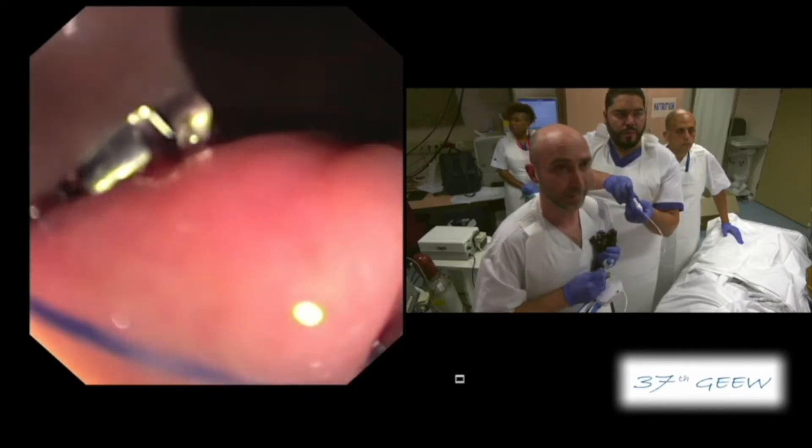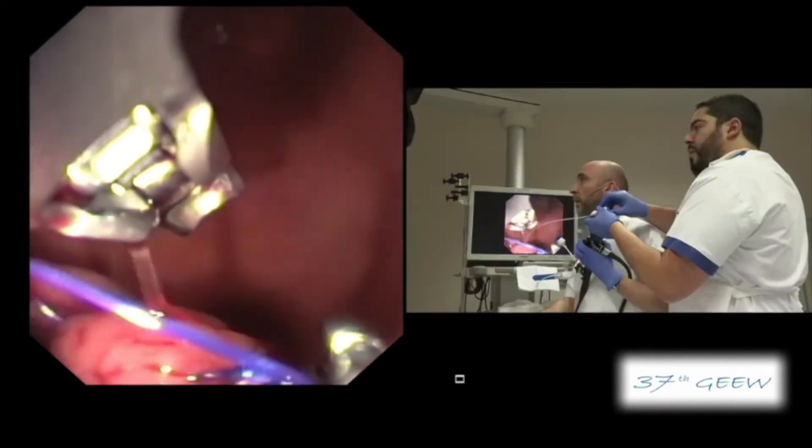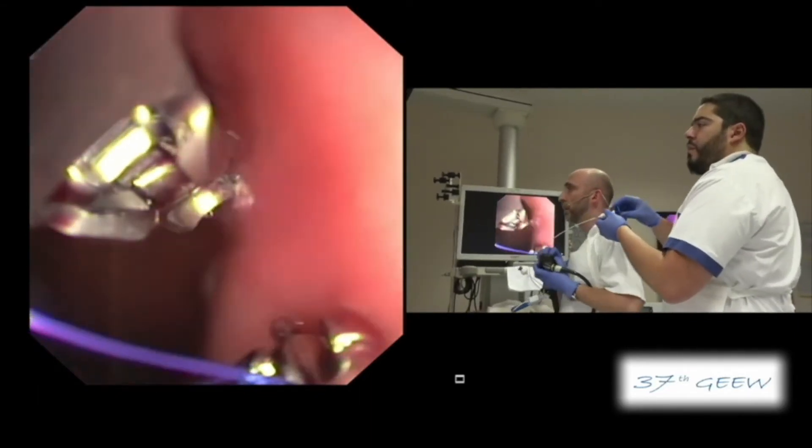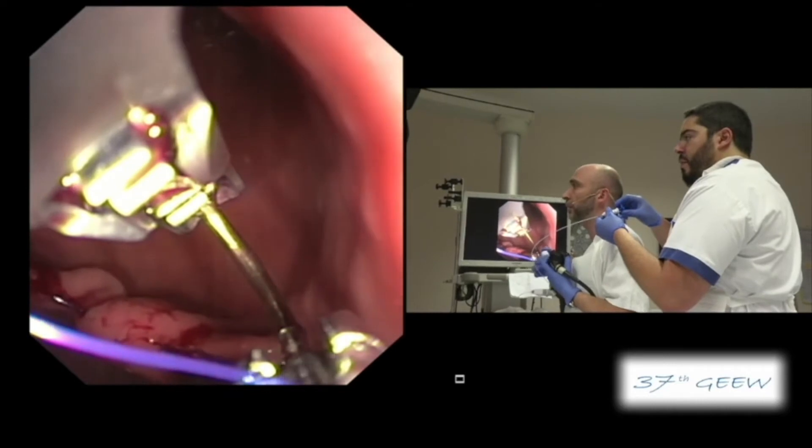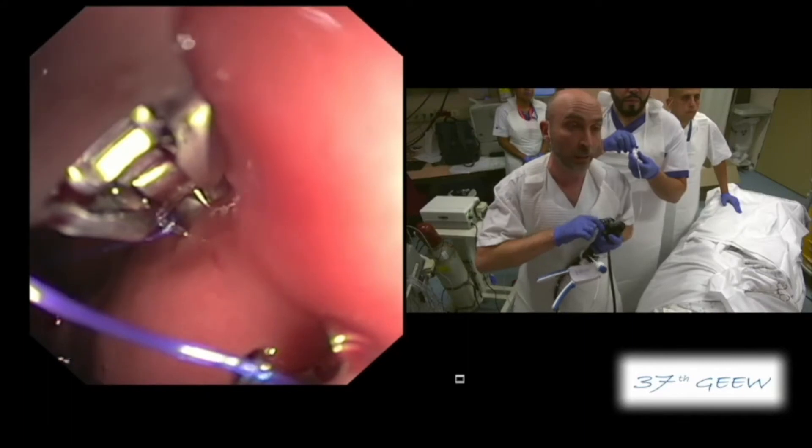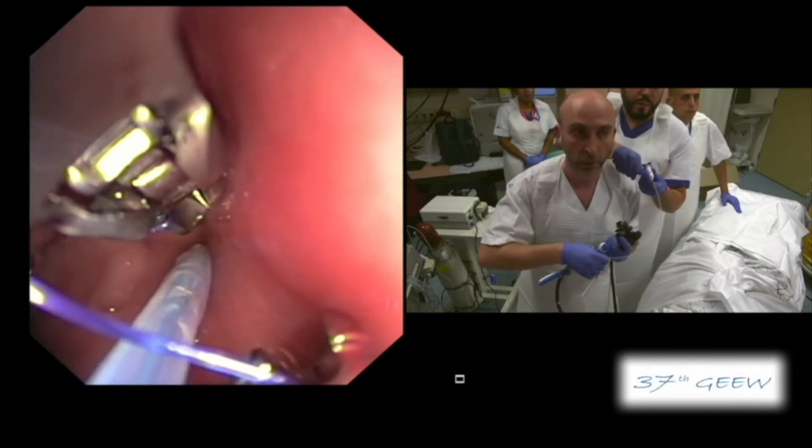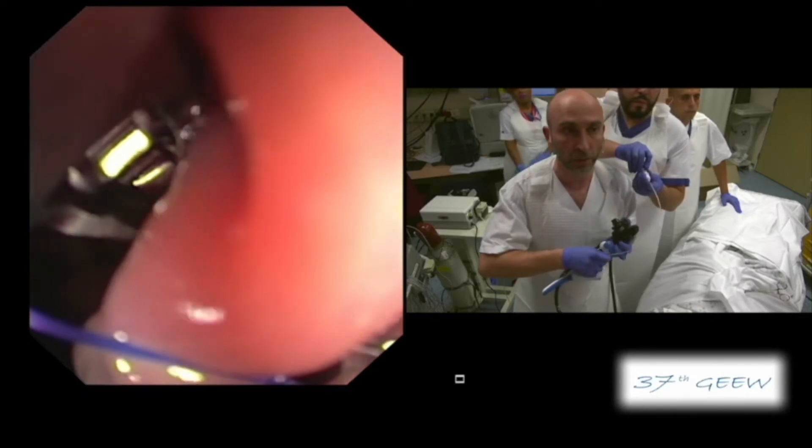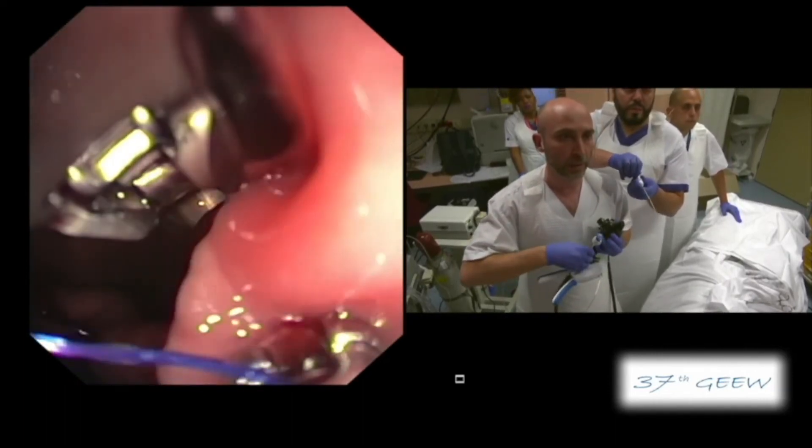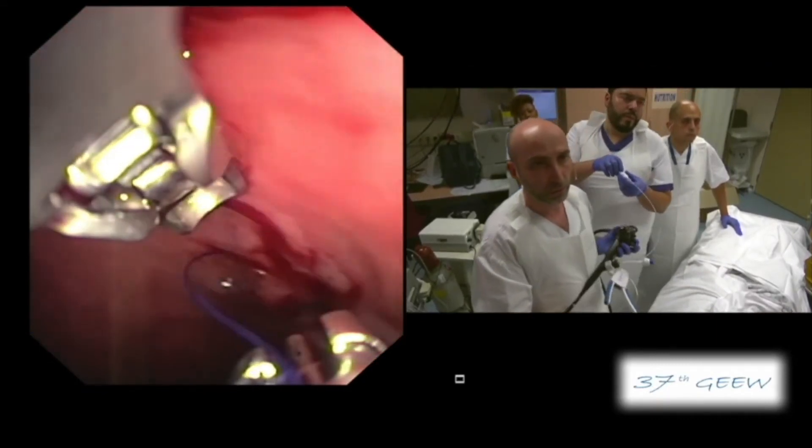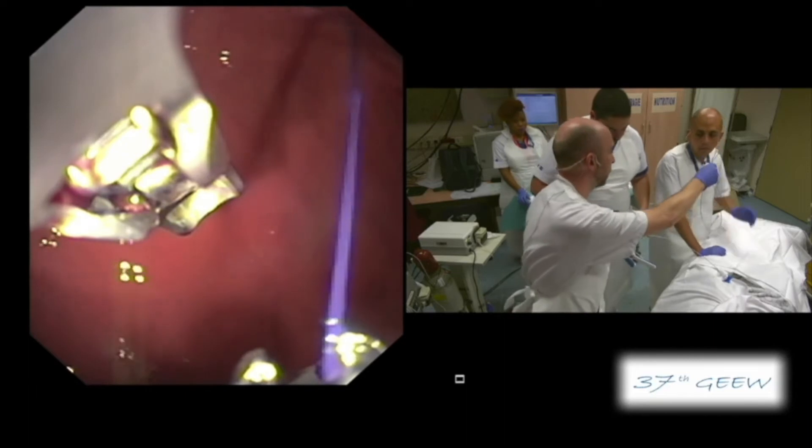So Ivo, these sutures are conceived to be transmural. Yes. And that's why you avoid the antrum? Of course. We always avoid the antrum because the suturing of the gallbladder has been reported and adjacent organs. So we always need to be sure. We cannot be sure, but the only way to stay far from anything that could be from the other side is to pull the gastric wall to us and not do more than three turns if not needed. Sometimes it is needed because the gastric wall can be very thick. And this is why we avoid that. So now we are ready to close here.